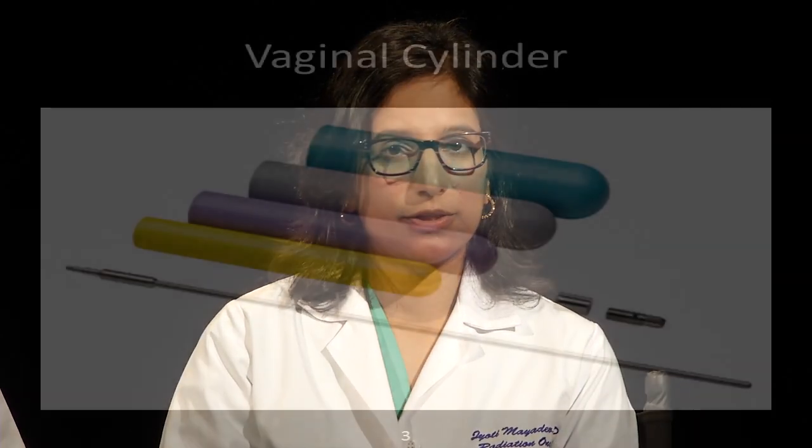Similar to the tandem and ring or tandem and ovoid, which is used to treat cervical cancer, a type of applicator called a Y applicator is used to treat endometrial cancer in patients unable to undergo surgical resection. The Y applicator is inserted through the cervix and then into the uterus. There are typically 3 to 4 treatments requiring a device insertion for each treatment. Following the completion of each treatment, the applicator is then removed.